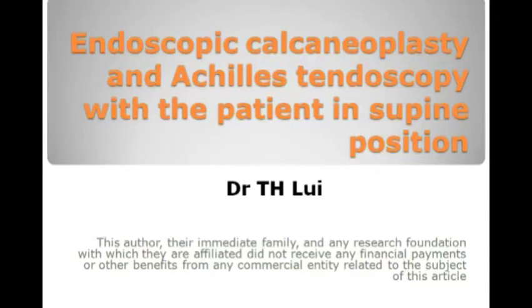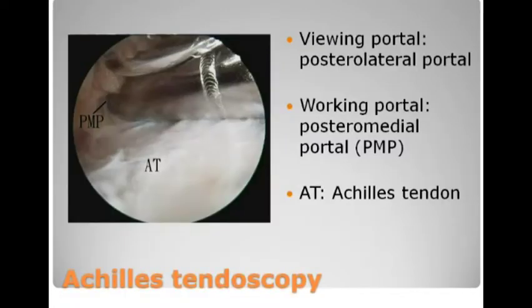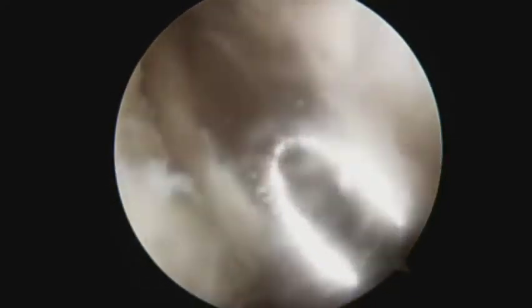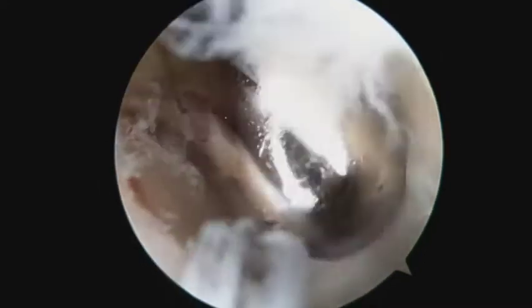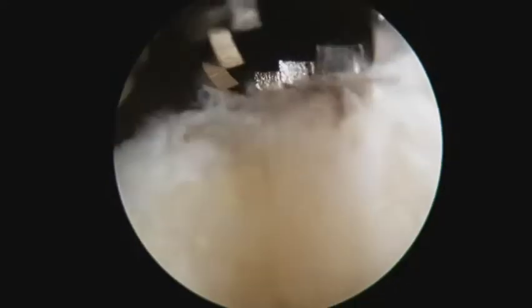Endoscopic calcaneoplasty and Achilles tendoscopy are performed with the patient in the supine position. This is performed through the posteromedial and posterolateral portals close to the Achilles tendon insertion. The posterolateral and posteromedial portals can be switched as the viewing and working portals.